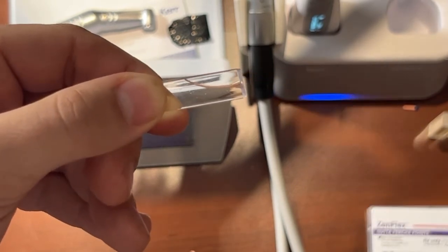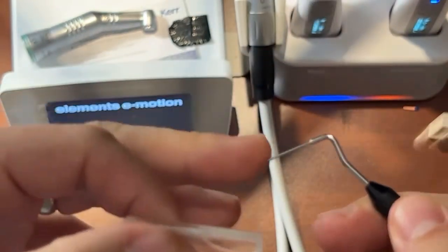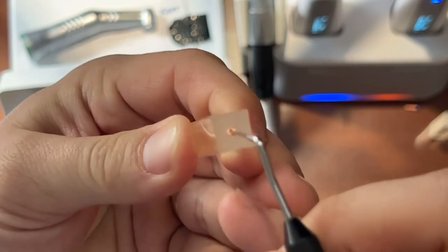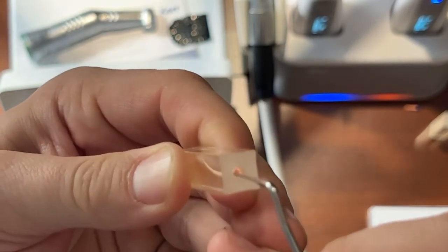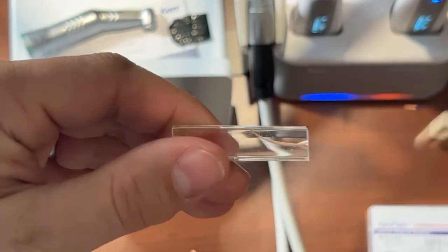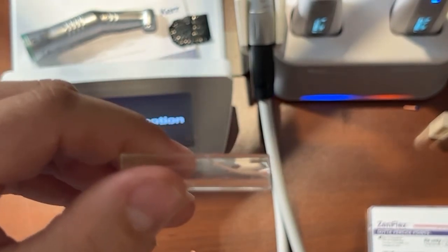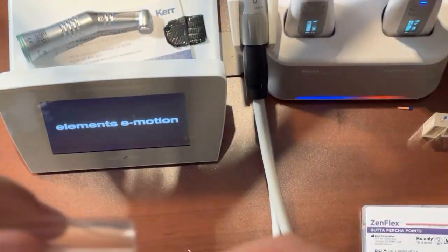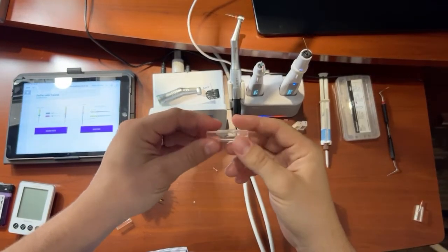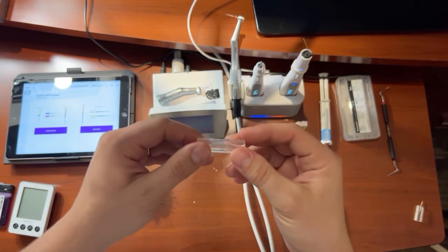There we go. So now we have backfilled out of the canal, and I'm going to take this stainless steel side. You can see that we've got gutta percha at the orifice. I'm going to start to pack that gutta percha down just to condense it even more. And we have a nice, beautiful 3D filled root canal. It's gorgeous, it's a thing of beauty. So that is essentially all of the steps for how to do warm vertical condensation for your obturation technique. So that is our entire endo protocol.